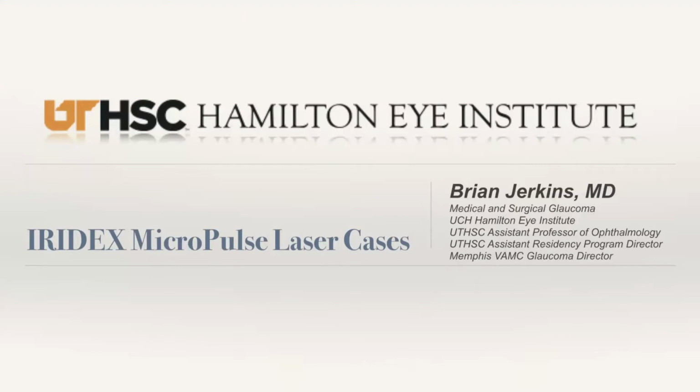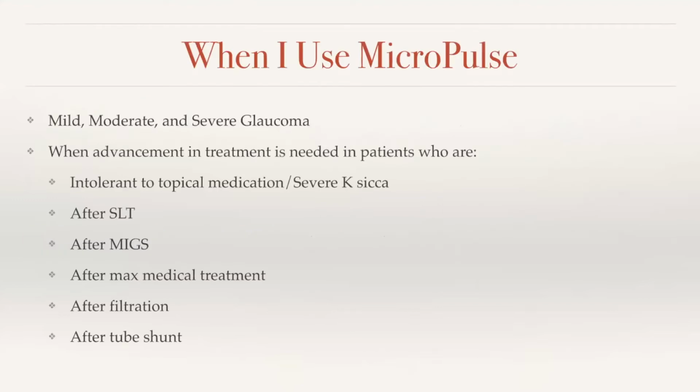Really, any glaucoma patient. It can be a patient with mild, moderate, or severe glaucoma, so there's no limitations there. Really, for me, it's whenever I need to advance treatment in any patient situation, whether it be a severe dry eye keratitis sicca patient who's having difficulty with medication or intolerant to some. It can be after an early glaucoma patient who's failed SLT. They could have had previous MIGS surgery, and you take your choice of which MIGS. It can still be used and utilized after any of them that are currently available.